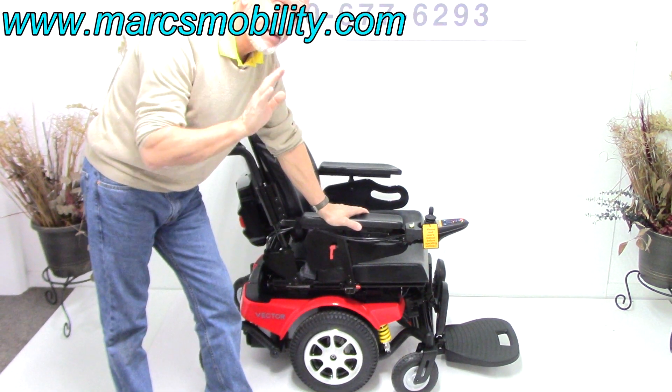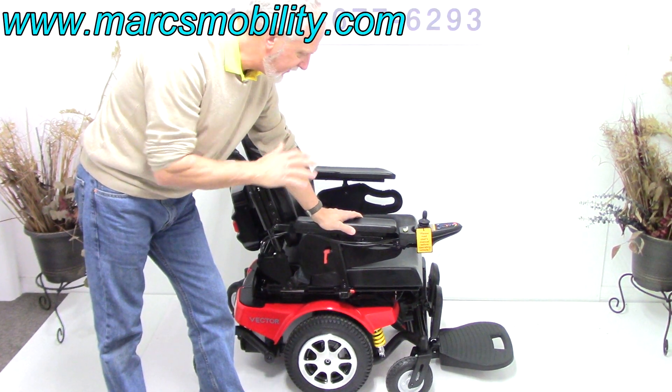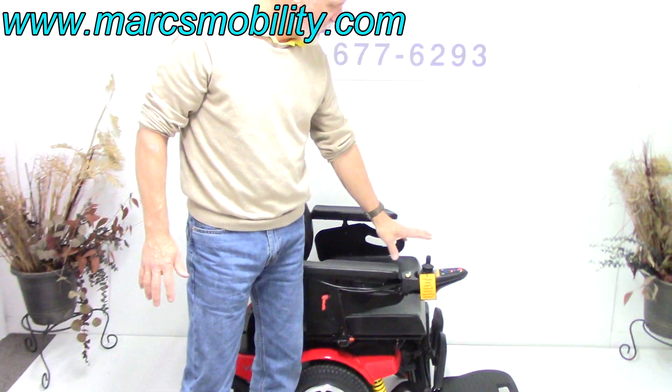This power chair has electric tilt, electric recline, and electric legs, along with many other features which we'll cover in a minute. All the features have to be worked through the joystick.